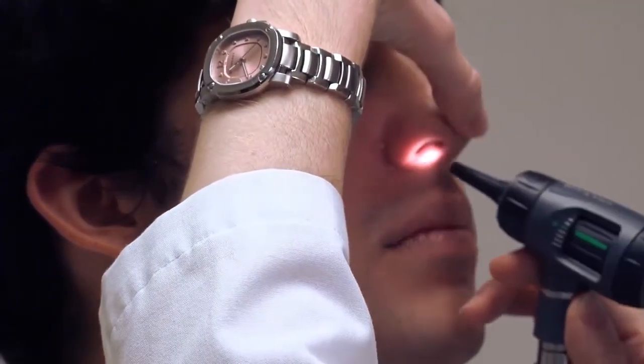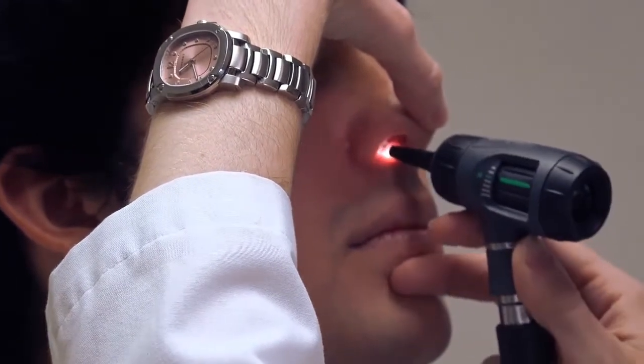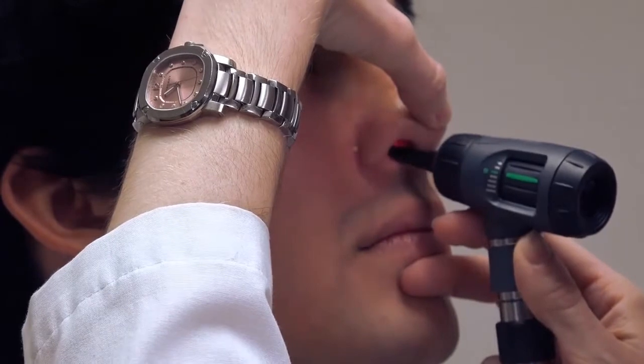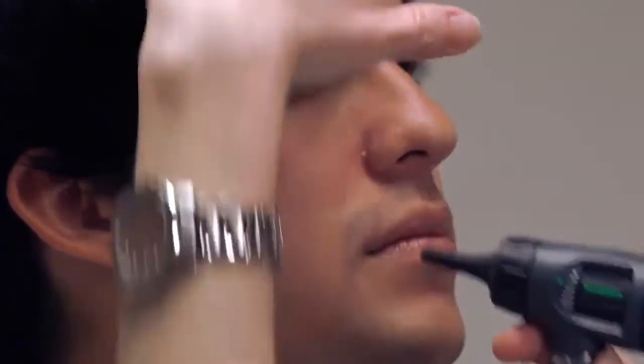For the other nare, follow the same pathway: brace your finger on the patient's face, insert the otoscope past the hair, and quickly examine the septum and nasal turbinates — again looking for areas of redness or swelling.